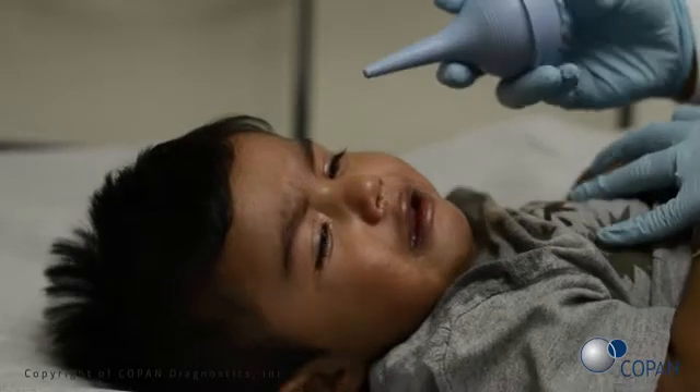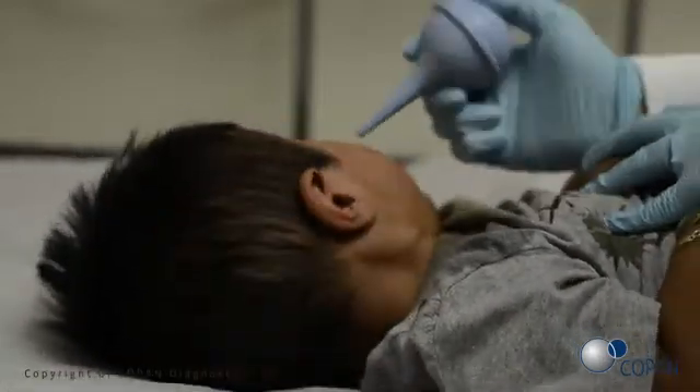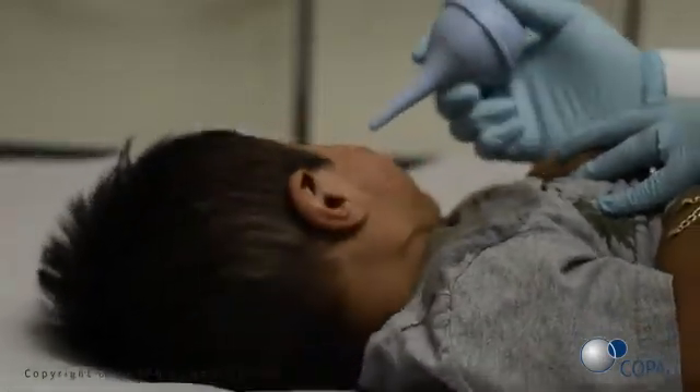Insert the tip of the bulb into the nostril and dispel saline into the child's nostril. If an obstruction is encountered, try the other nostril.